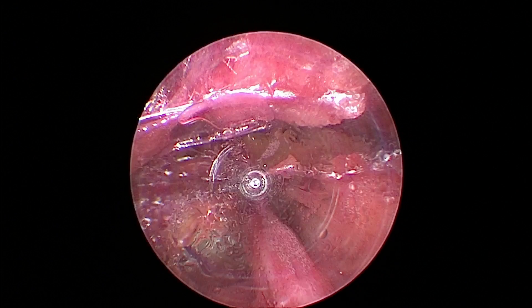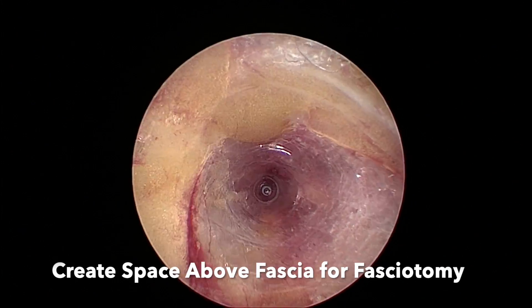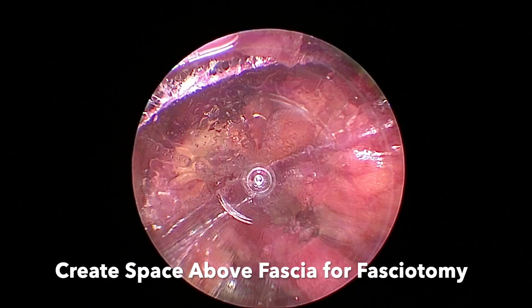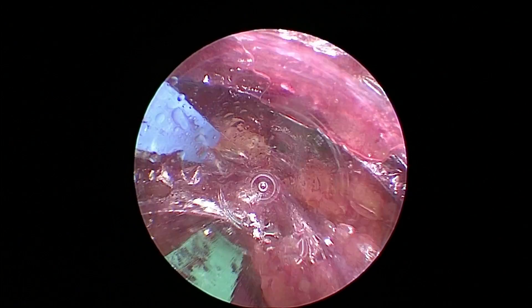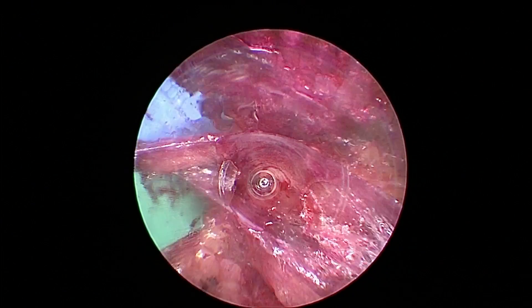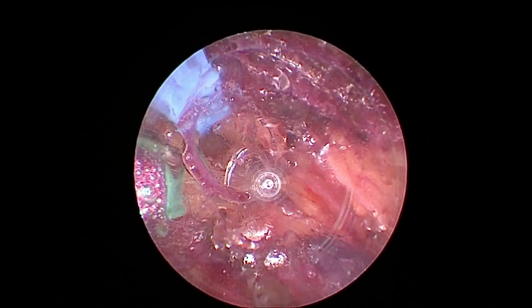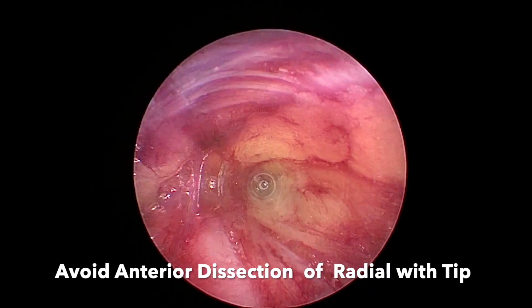I like to make some space above the fascia so that I can more carefully and easily take the fascia down. You never want to wedge the tip and drive the tip of the device in between the fascia and the radial artery. You don't have to do that with this device — you just create some space, do your fasciotomy, and then work lateral to the veins. That's how you open up the tunnel. You're not going to push the device over the top of the radial artery — if I push that, I damage it.